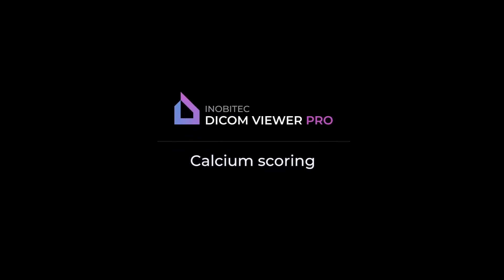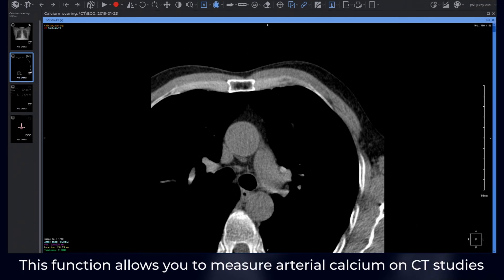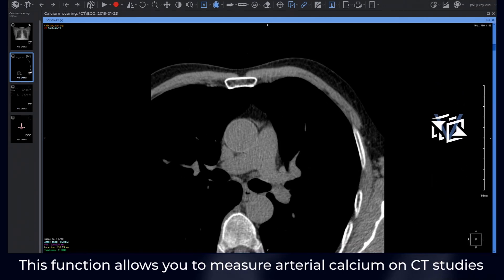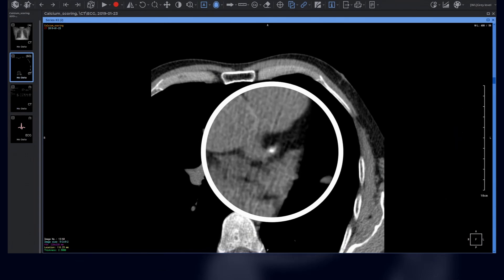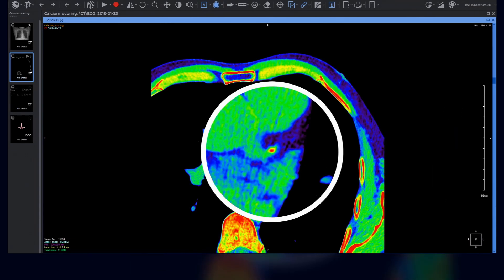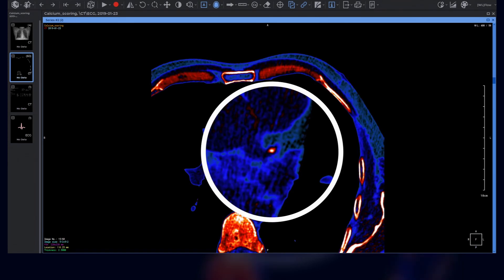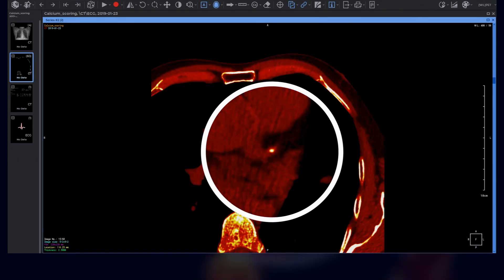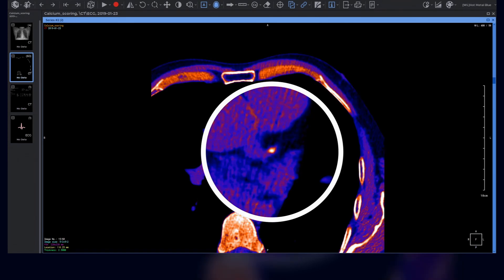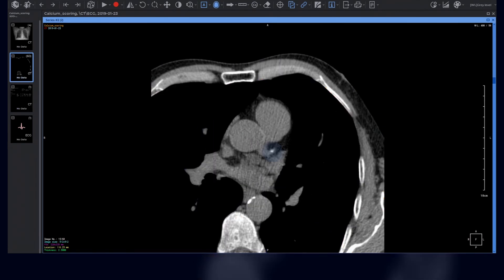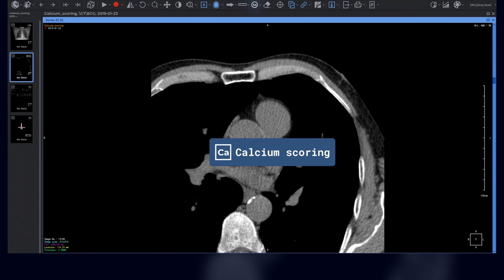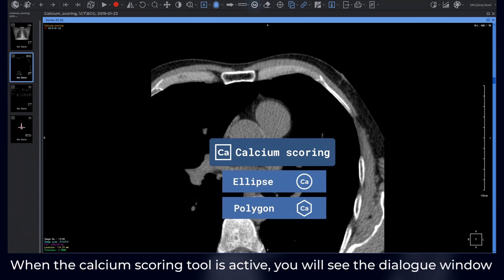InnoBetech DICOM Viewer Calcium Scoring. This function allows you to measure arterial calcium on CT studies. When the calcium scoring tool is active, you will see the dialog window.